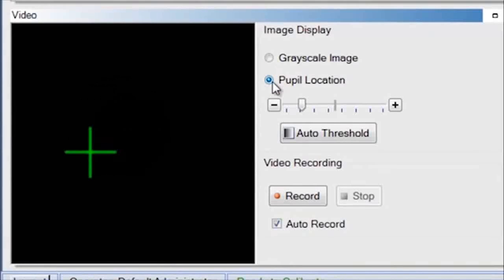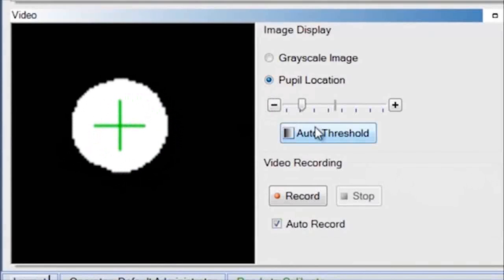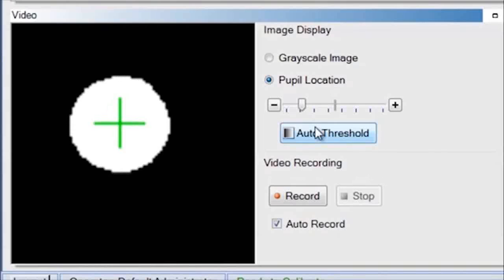If the pupil has not been identified, you want to select auto threshold. The system centers the crosshair on the pupil.